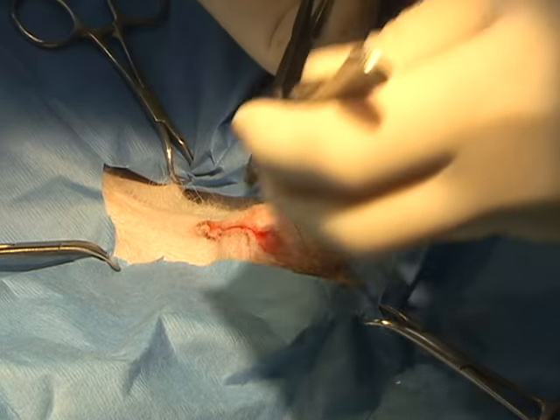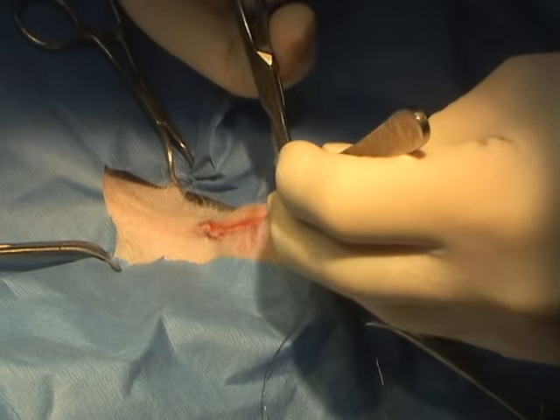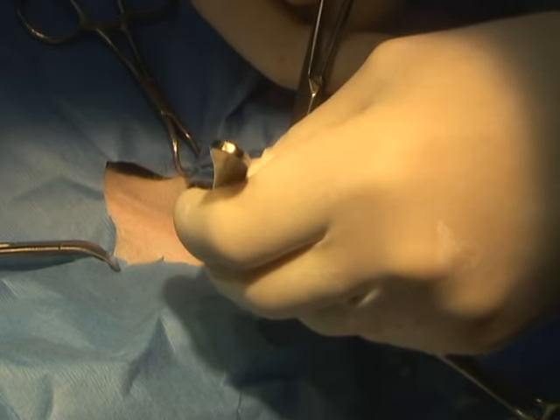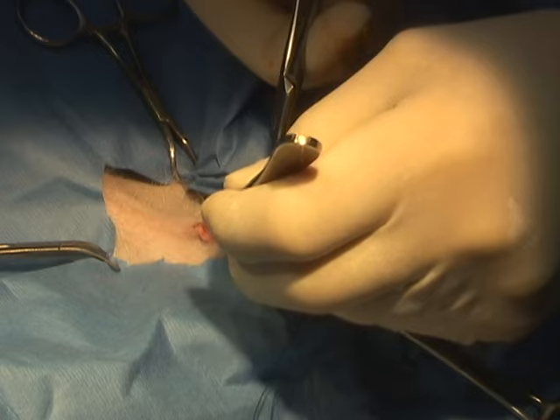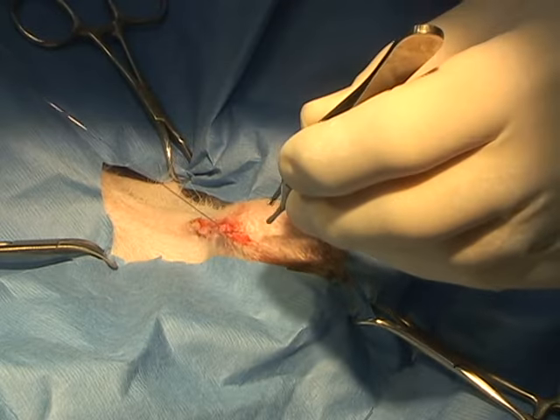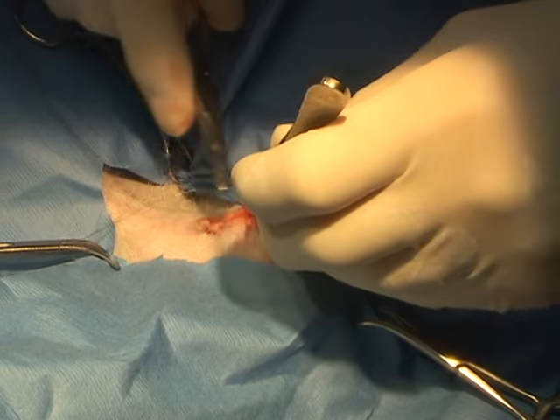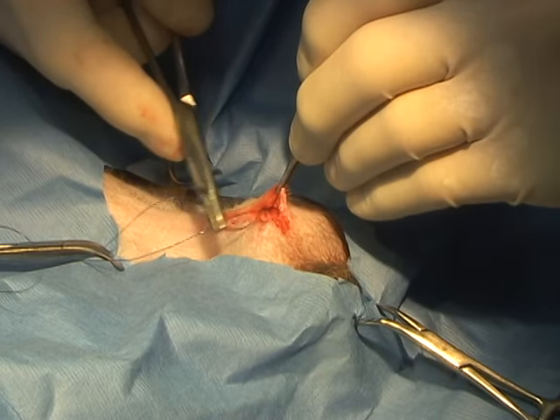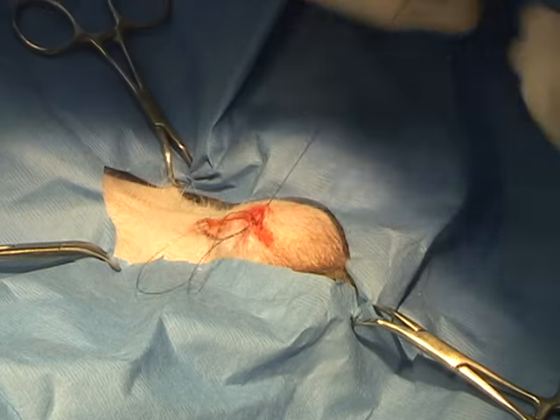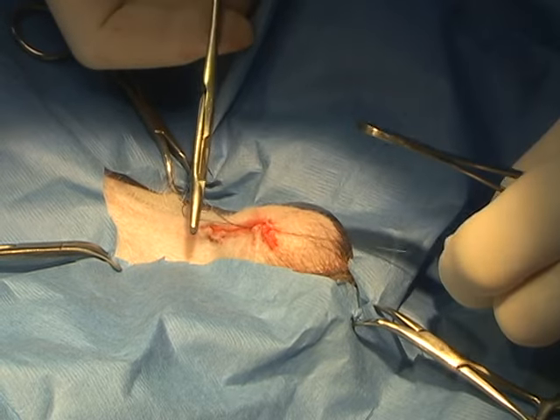We bury the knot, going back cranial in the incision, so that the knot is buried and attached to the fascia underneath the skin, and that way there's no exposed knot and no irritation. This is the point where we bury the knot in the fascial tissue. We go around the end of the incision, come back to anchor the material, and then it will allow us to pull the incision closed back around the knot, and then the skin will cover it over.